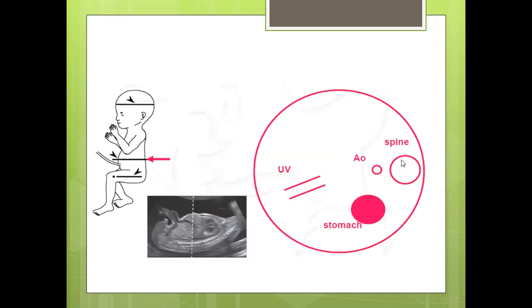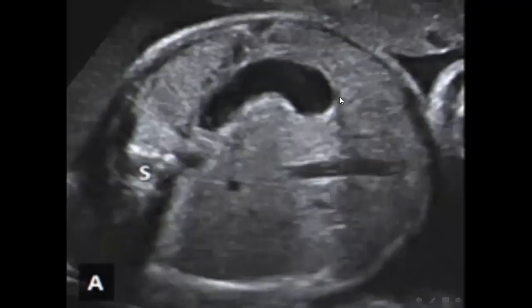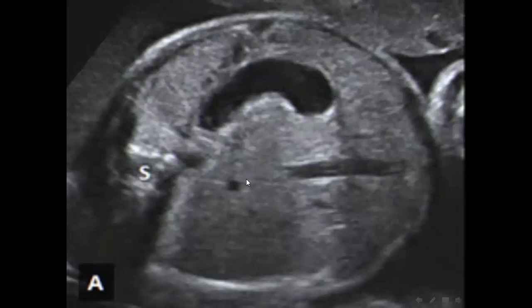Looking at this picture: this is the spine, this is the descending aorta, this is the intrahepatic umbilical vein, this is the stomach, and this is the cut section just above the umbilical — the ideal cut section for abdominal circumference. In the next picture, the spine is at nine o'clock, and we can identify the descending aorta, the short intrahepatic umbilical vein, and the stomach. This is a circular section with an unbroken rib echo — this is the ideal position to measure abdominal circumference.